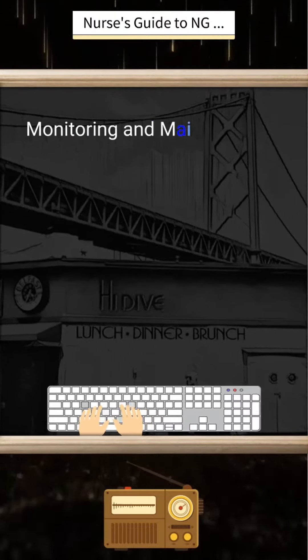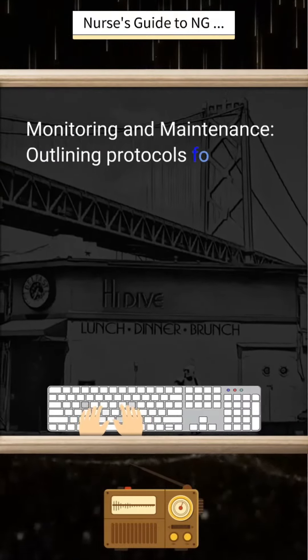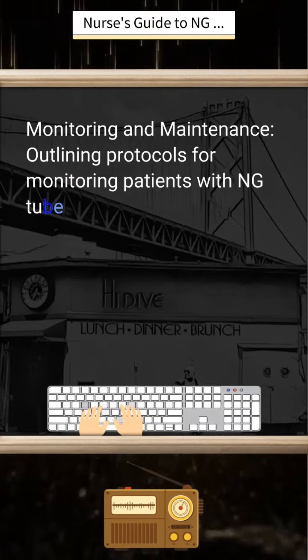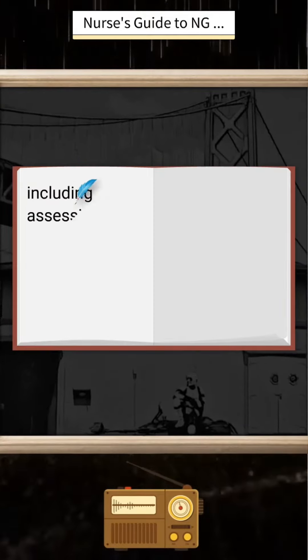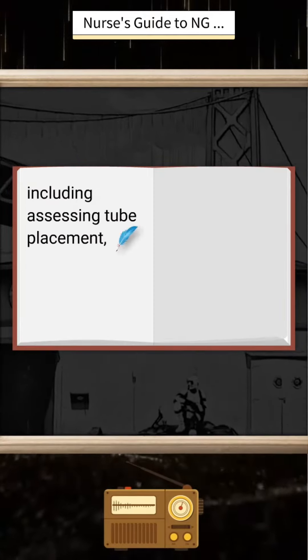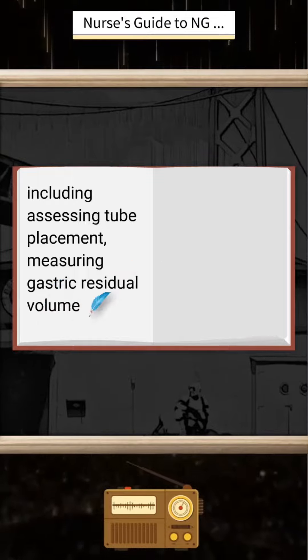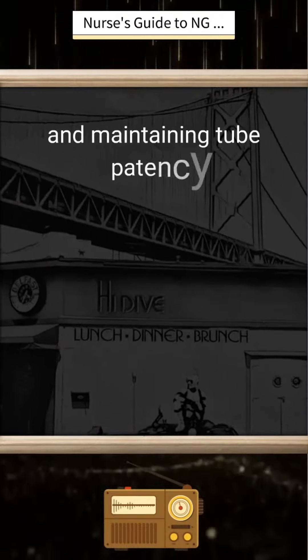Monitoring and maintenance protocols are outlined, including assessing tube placement, measuring gastric residual volume, and maintaining tube patency.